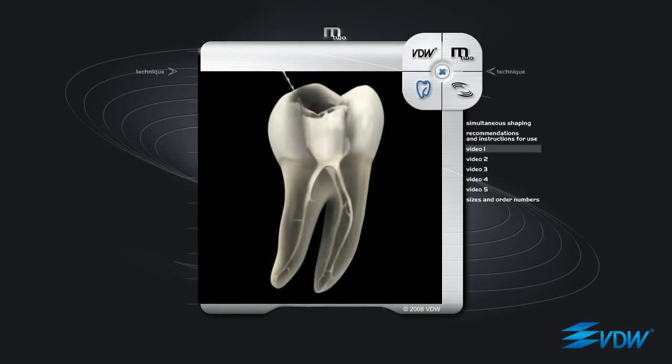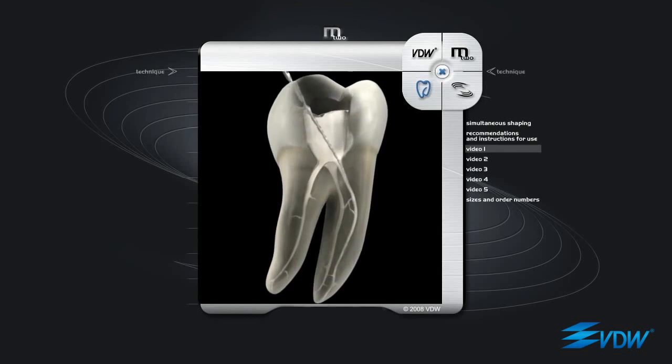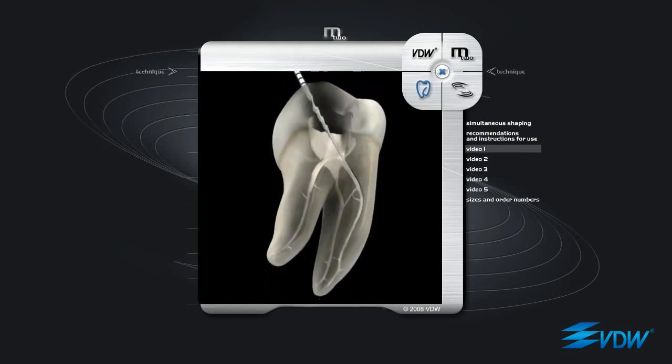The alternation of passive filing and incremental progression is not always required. In easy canals, the instrument can proceed naturally to the apex without any interruptions. In other cases, passive filing could be necessary just once, whereas in very complex cases, like this lower molar mesial canal, passive filing is necessary several times until the apex has been reached. This will enable the following instrument to work with ease.